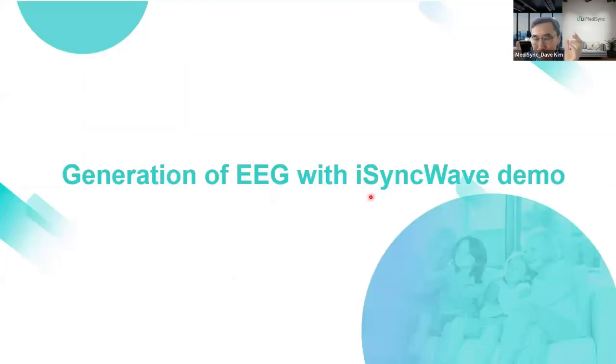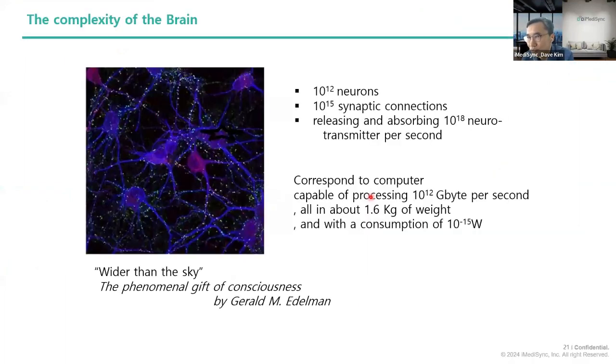It is very important to understand how the EEG rhythm is generated, so I'd like to introduce the EEG generation mechanism.